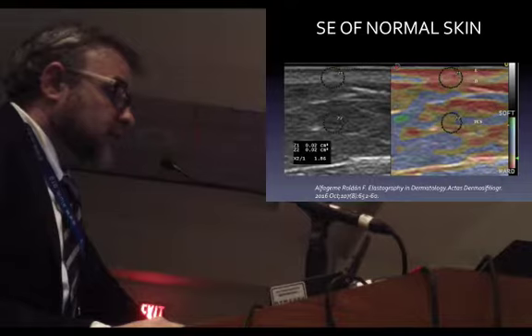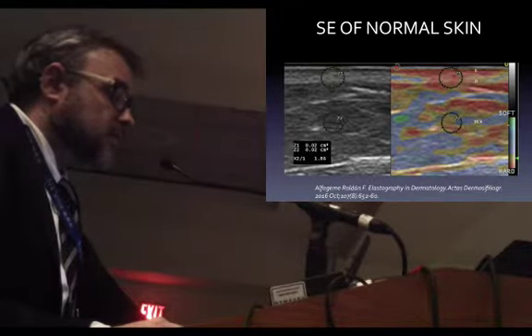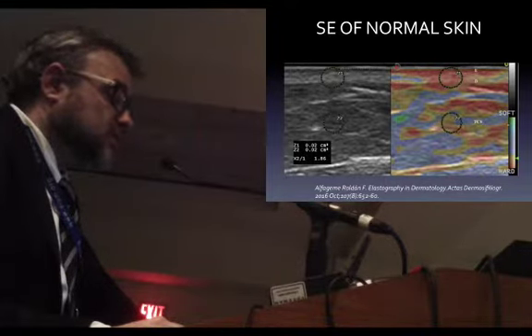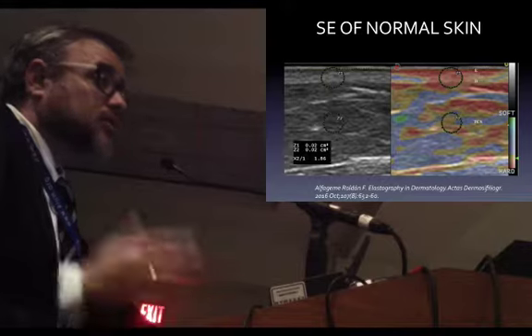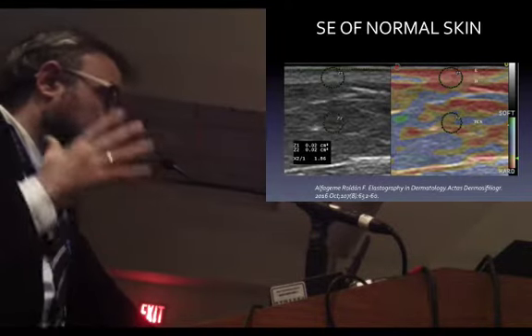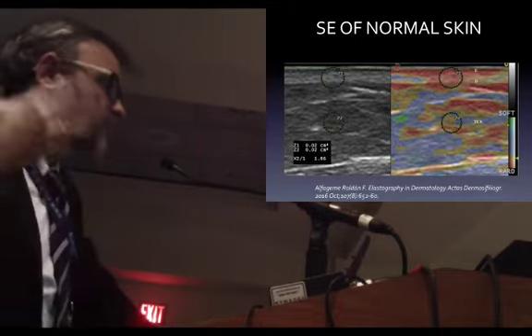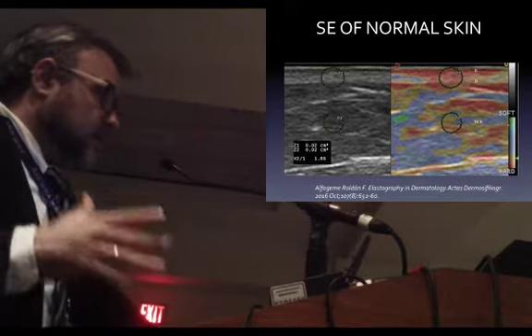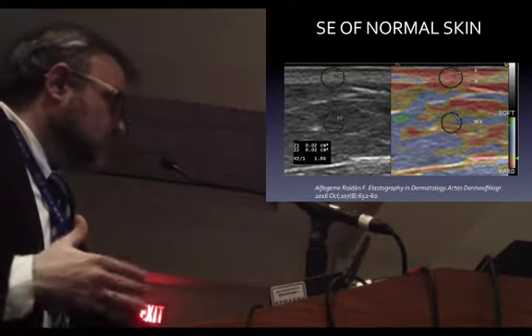Fat is usually softer than collagen. Then we see it in this bluish or greenish color. You see here these tracts, which are the collagen tracts you've seen with Dr. Bosman in panniculitis. Then we have a correlation of the hardness of the structures you've seen before in B-mode. You have to take that into account when you come to diseases.